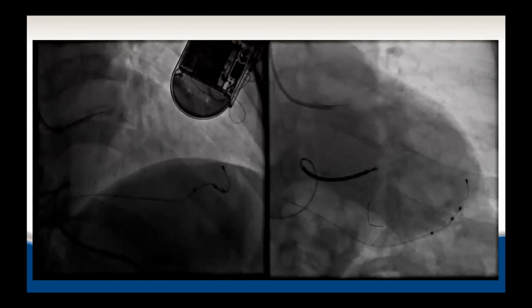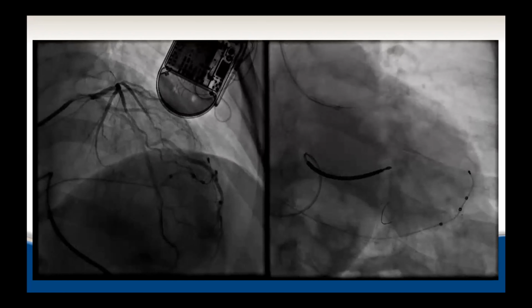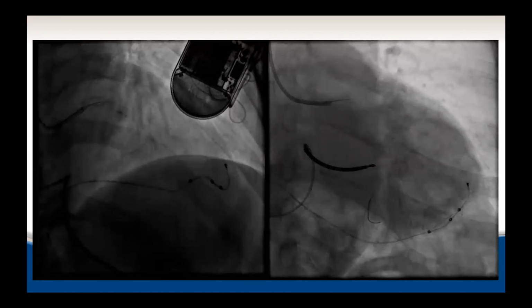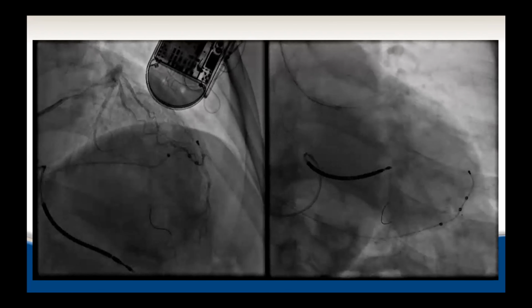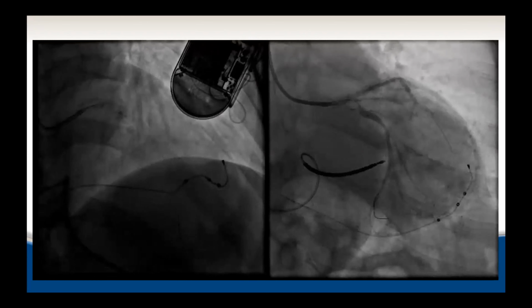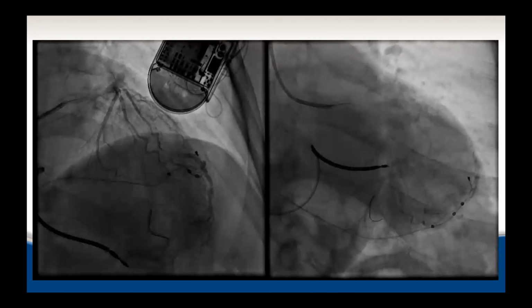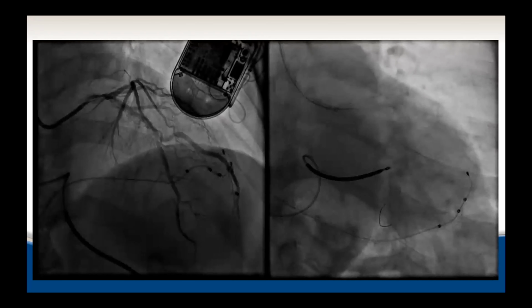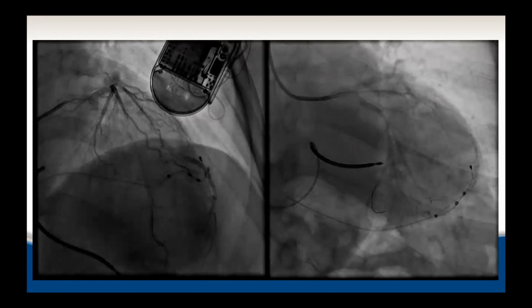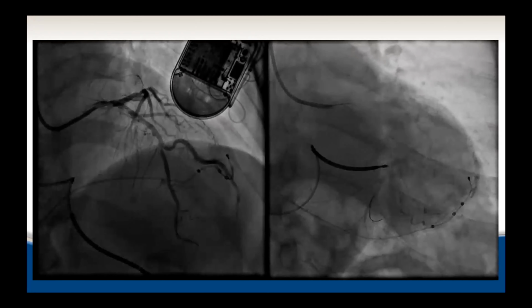Yeah, I think it depends a little bit on what the tortuosity is. The teaching always, Cal's probably much better than us at CSI, but I think the teaching's always worried about severe tortuosity. But I think of that more in vessels where it's such a severe curvature that you have a lot of straightening artifact. This one is such that the angles are, no matter what, there might be issues, but if you rota that, you're going to have a big gutter there. So you better be prepared to see that and have dissection plans and so on.